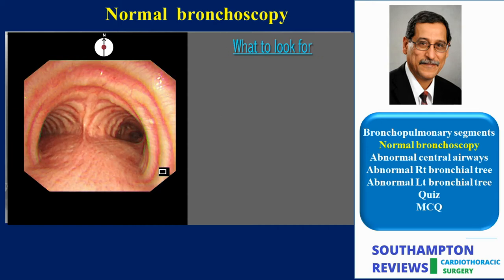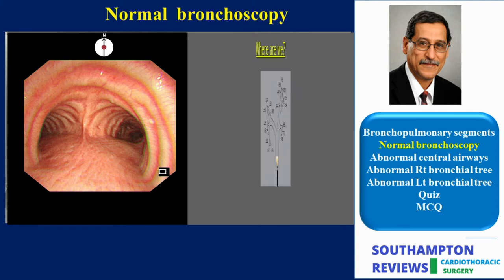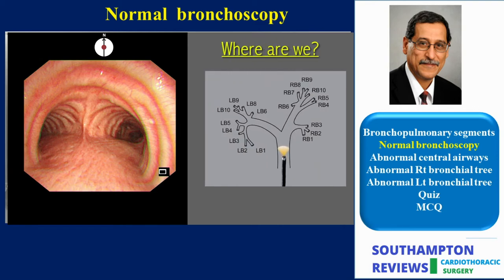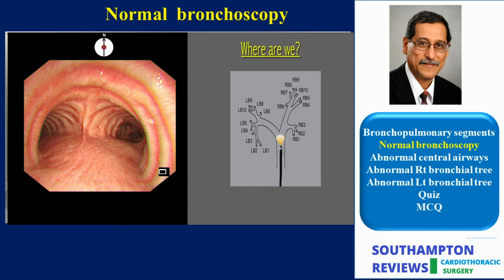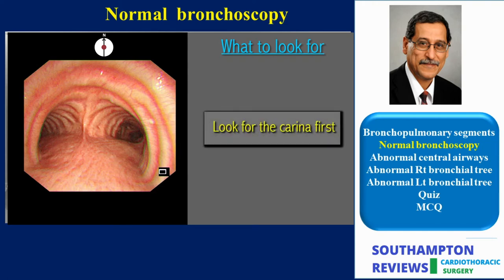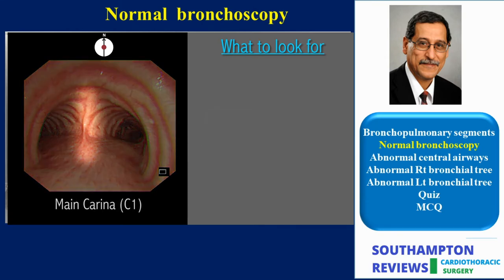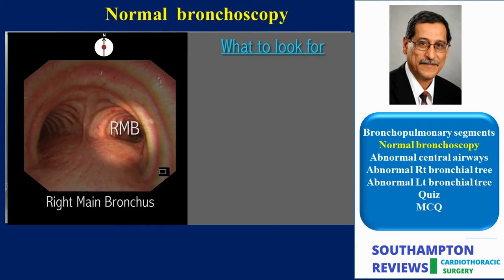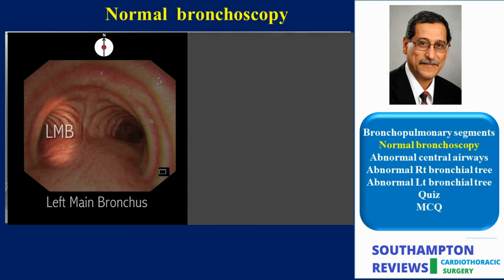As the scope is further advanced and the lower orifices come into view, we tend to notice the bronchial orifices first. In this video I aim to change this basic instinct of seeing bronchial orifices first and replace it with a new concept of thinking and seeing carina first. To my mind, identifying the proper level of carinae is the secret to diagnostic bronchoscopy. But for now let us identify the sharp main carina, or C1, which is the first level of bronchial division, dividing the trachea into right and left main stem bronchi.